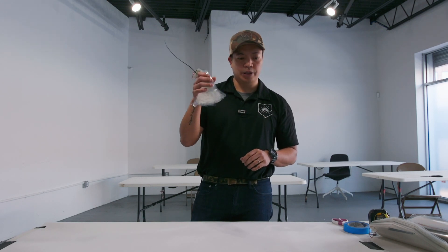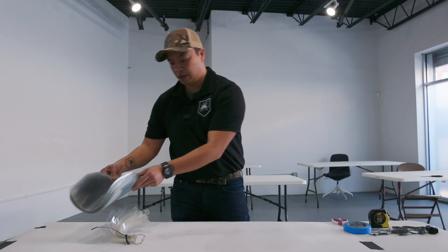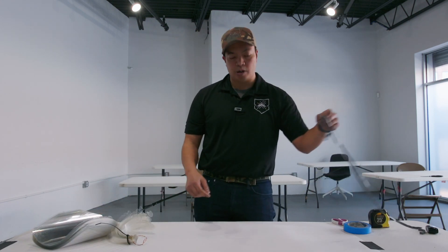So we're going to start with the face shield pieces here. We'll be distributing these — we'll either organize a drop-off or a pick-up.